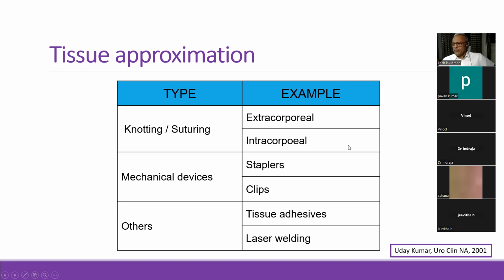So what are the things that you have to bear in mind when you're fashioning an extracorporeal knot? The thread length should be 60 to 90 centimeters. Excellent. You have a long thread length, very good, because you have to go in and out, fashion everything. The knot shouldn't be too tight, so that the knot should slip. If there is a very high coefficient of friction, where it gets stuck, you can't slide it down. So you use a material which you can relatively easily slide down. Those are the two simple things, but the important thing is the length.